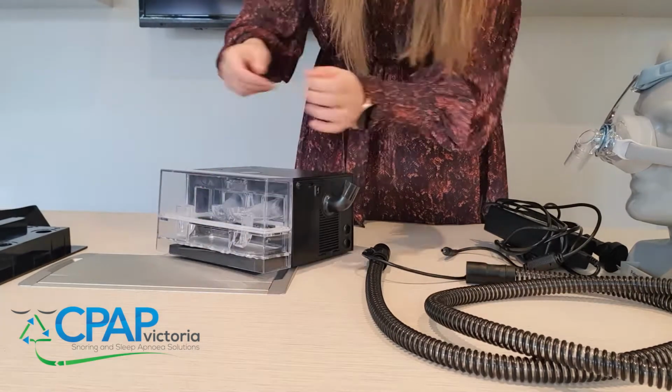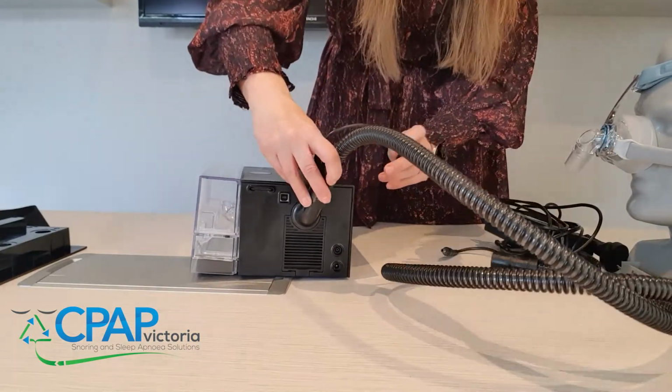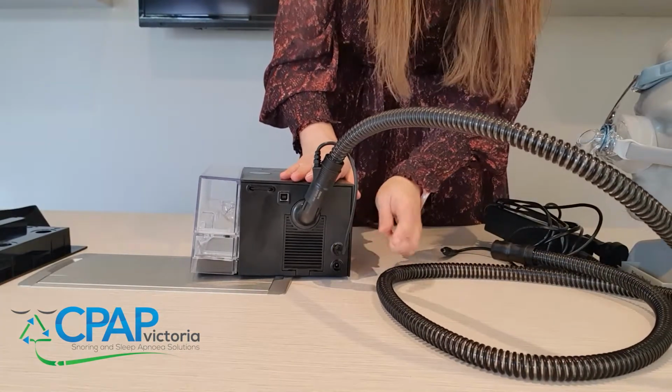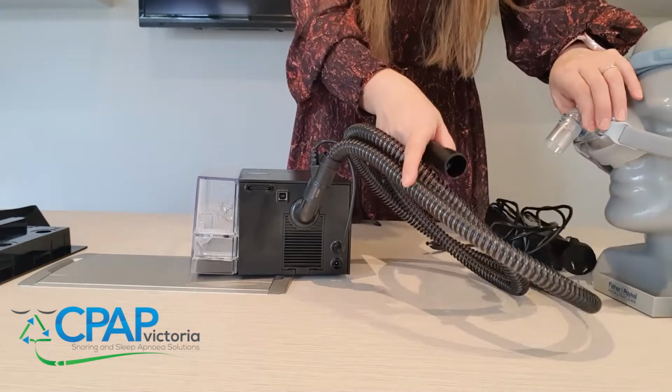Next, we have the heated hose, and the heated hose has its own little heated electric connection that goes into the device, goes into that top position. It will not fit in the bottom position, which makes it easy to remember. And then you can just attach your mask as per normal.